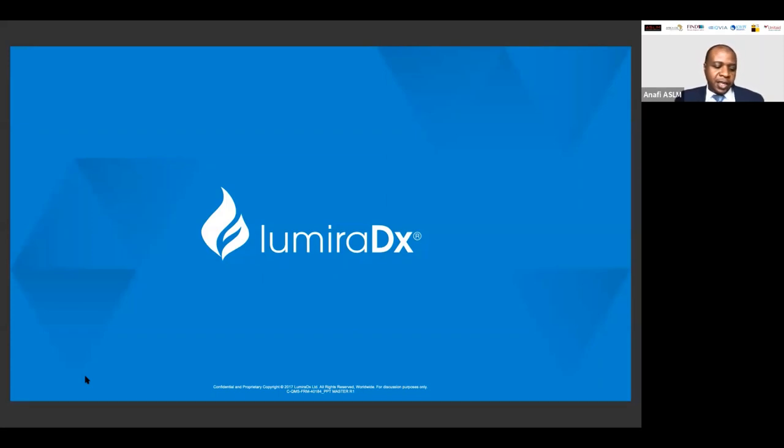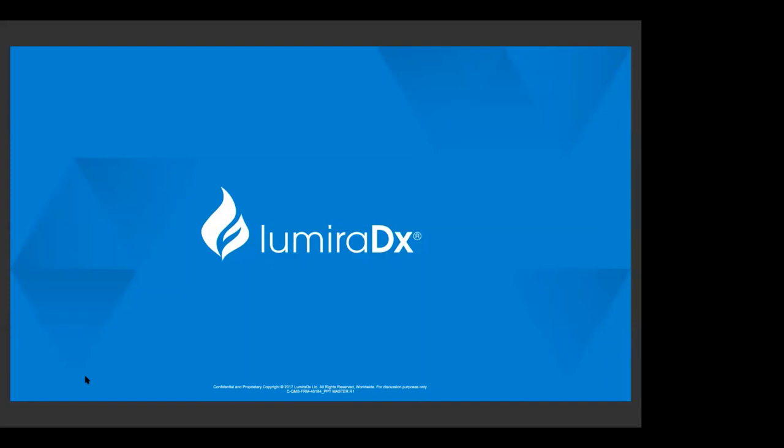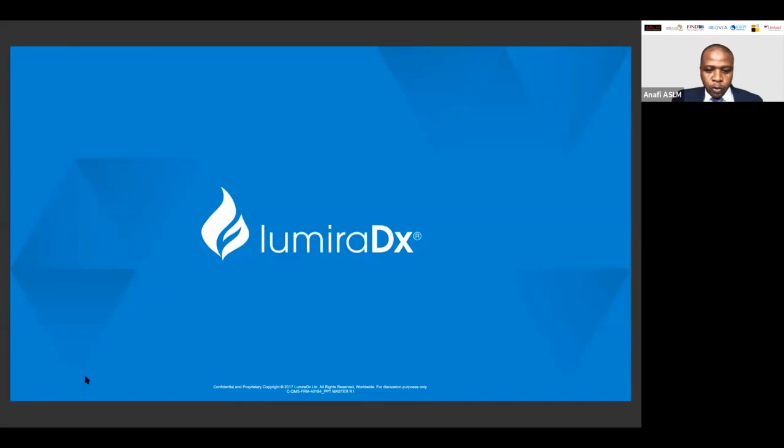Stuart Nice Knight says, where is patient data stored? Is it on servers outside the host country? Does Lumira have rights to data use? Mark, do you want to answer that, or do you want me to answer that one? I'll answer the first part of that question, Anafi. The data is sent to the cloud and then stored in the Amazon warehouse that has just been launched in Cape Town. From a factory manager perspective, we don't get to manage any of that patient-specific data. That would be purely for quality control purposes. Thank you, Mark. You mentioned you don't actually own the data. That's fine. Thank you.